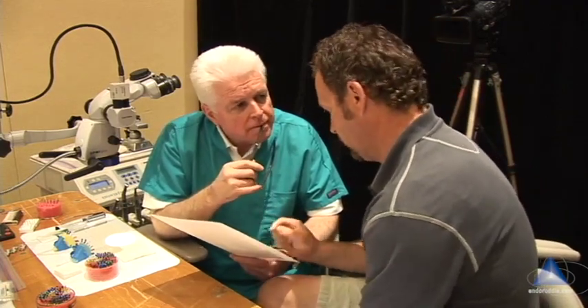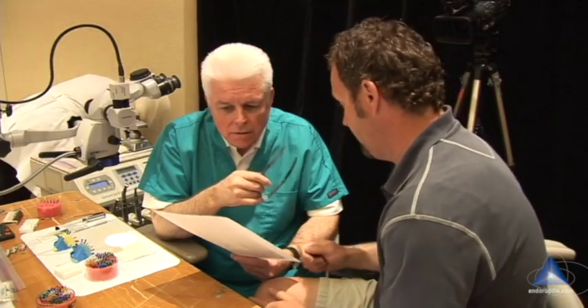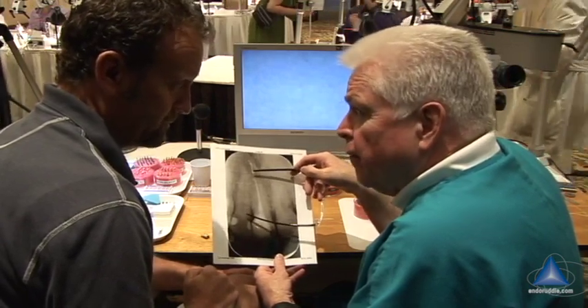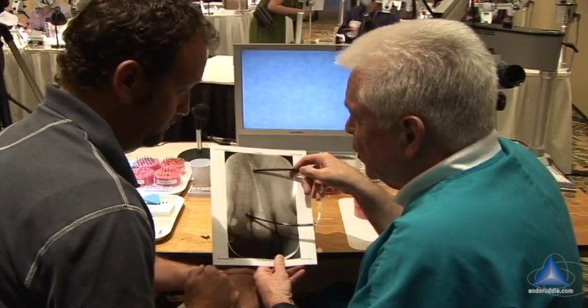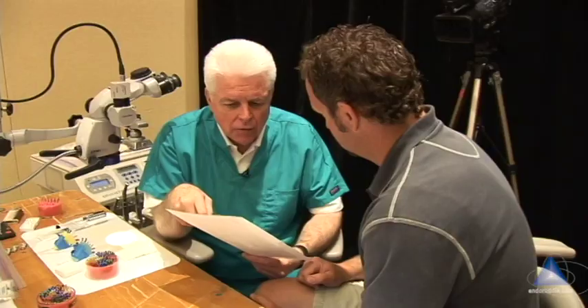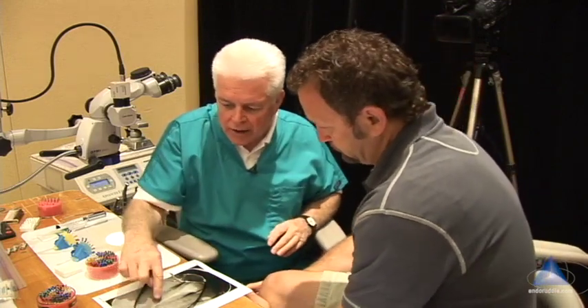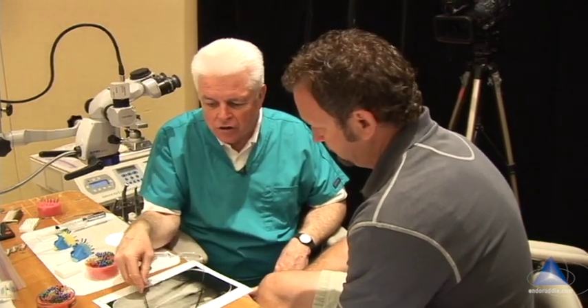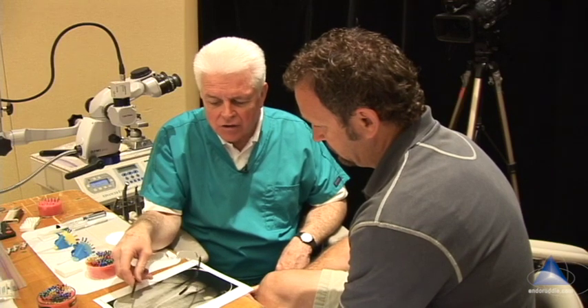I'm wondering if maybe my sealer's too thin, being mixed too thin. My observation here is it looks like you're using more than you need, and it might be too thin, as you just said. That could explain this — either it's too loose or too much. But your shape is excellent. Sometimes you can get more surplus when you're parallel, when you don't have a lot of deep shape. If your deep shape is more like this, that's when we get over-extensions, excess sealer and or gutta-percha. It looks like you have excellent taper, your mechanics is good. I'm not thinking this is gutta-percha — I think your gutta-percha is ending about right on the money, so that means you had good tugback.